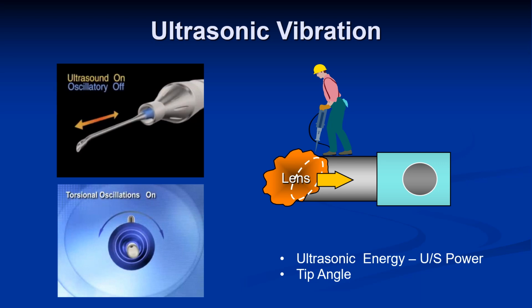The 45-degree tip is sharper than 30-degree tip and can cut hard nucleus better, but tip occlusion to hold segment during chop will be not so good. I prefer a 30-degree tip in all cases.